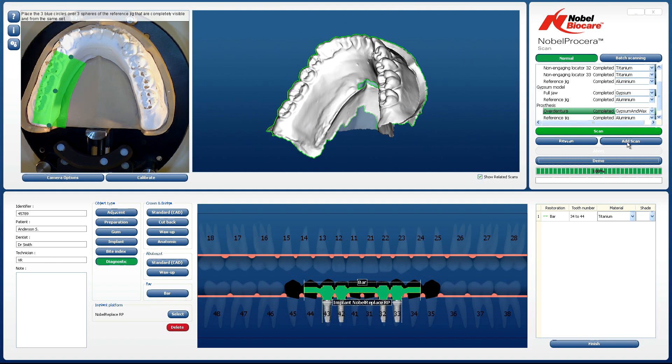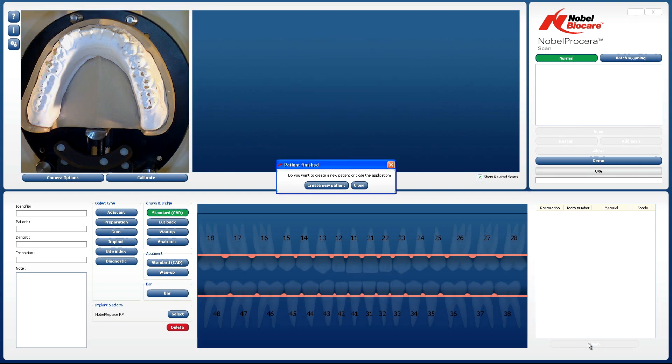When the scan is finished, click on the Finish button. Click on Close to start designing your framework.